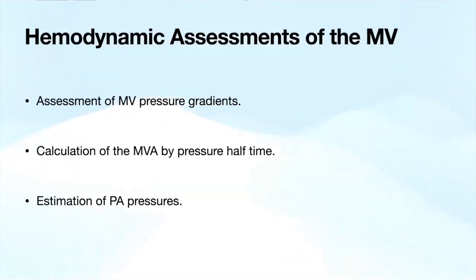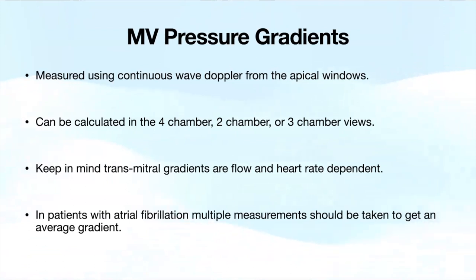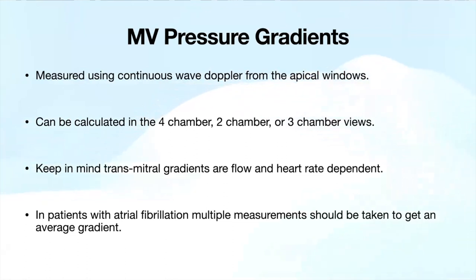For hemodynamic assessment, we want an assessment of the pressure gradient across the valve, calculation of mitral valve area by pressure half-time, and estimation of pulmonary artery pressures. Pressure gradients across the mitral valve are done using continuous wave Doppler from the mitral inflow from the apical windows—usually the apical four-chamber, but also looking at two-chamber and three-chamber. Transmitral gradients are flow and heart rate dependent, so it's important to comment on the heart rate. In patients with atrial fibrillation, take multiple measurements to account for beat-to-beat variability and get an average gradient.